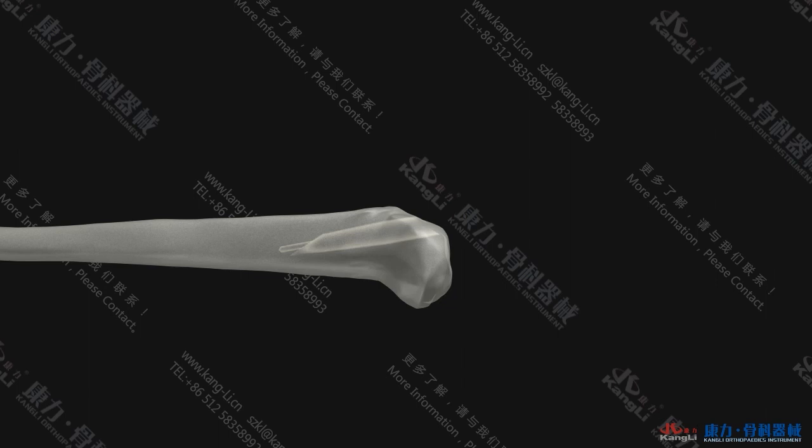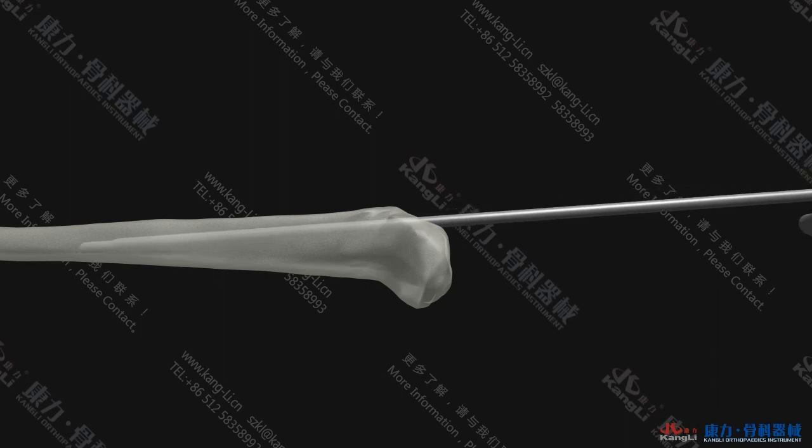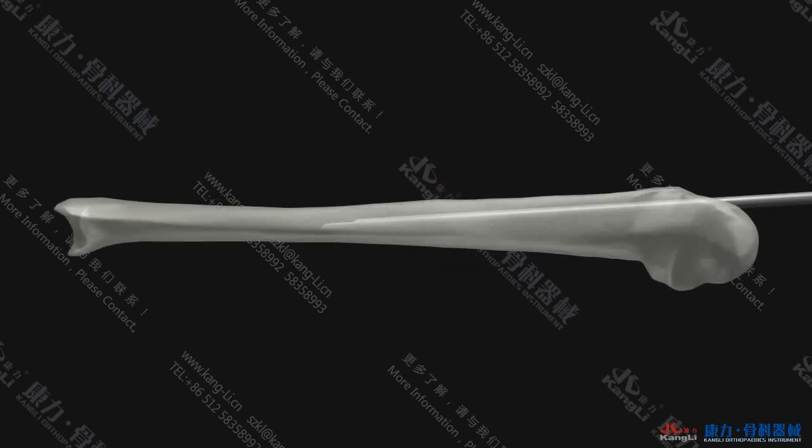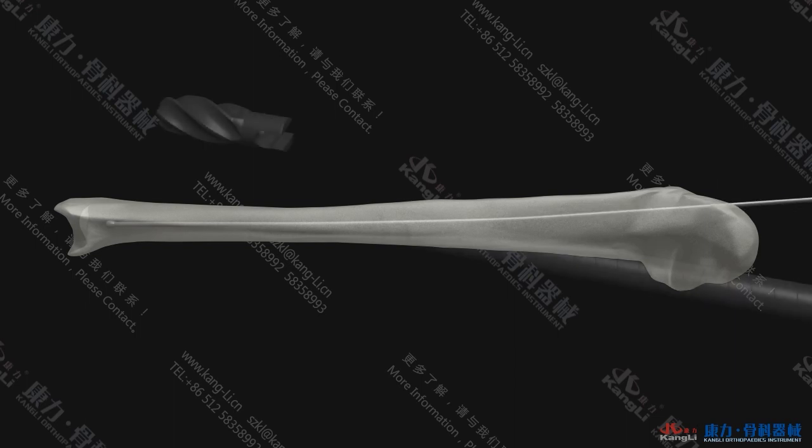Insert the guide pin introducer right through the fracture end under the monitor of fluoroscopy and by manipulative reduction. Fix the ball guide pin with guide pin holder and insert it along the central hole at the bottom of the guide pin introducer until the ball reaches the distal side of the bone marrow cavity. Remove the guide pin holder and the guide pin introducer.